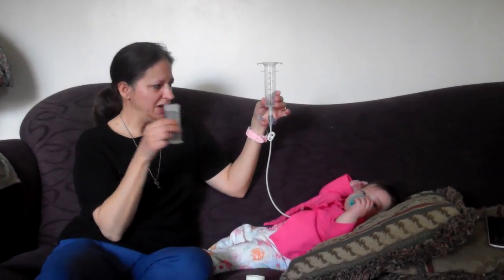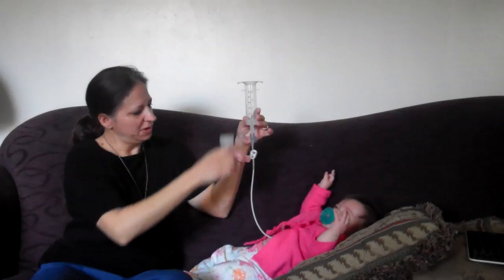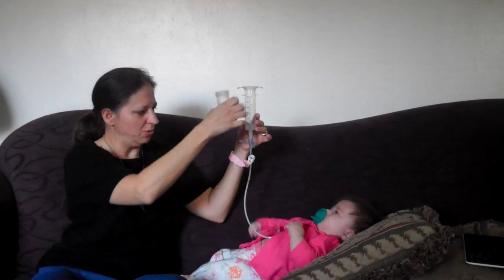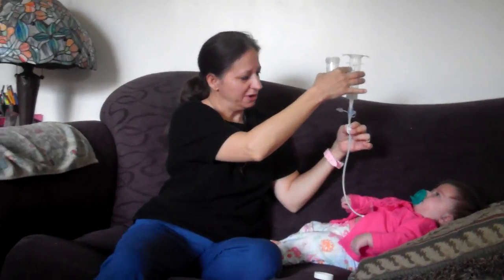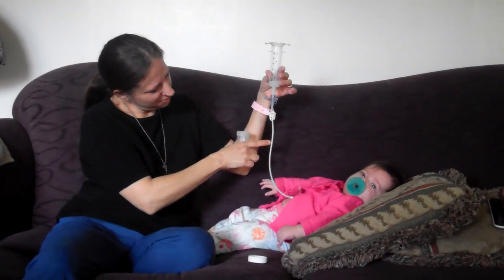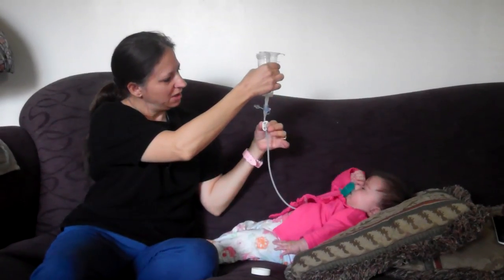She's coming down to the end. I'm going to pour some water in here that's going to flush the milk out and out of the button area down here. So when her milk is coming down to about here, I'll pour some water in. I'm clamping it right now because she's starting to push it back up, and then the milk gets a little bit too mixed with the water. I'm going to unclamp it. I'm going to watch. This is white. I'm going to watch for where it's more clear. And I'm going to clamp it.